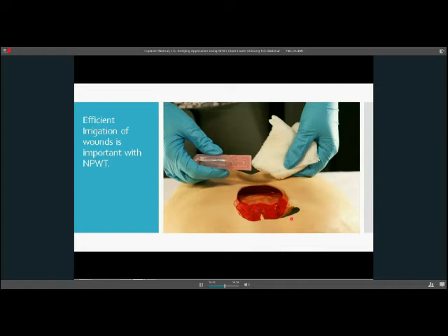You're going to want to irrigate your wound bed. I think this is one of the biggest things that nurses can do. Of course, you're going to follow your facility protocol. You're going to hear me say that an awful lot. But you want to irrigate. Now, we're going to bridge 2 wounds, so you want to irrigate both of the wounds as directed. But it's really important to irrigate well enough that any fragments, anything at all that's left behind, is going to wash out of that wound.